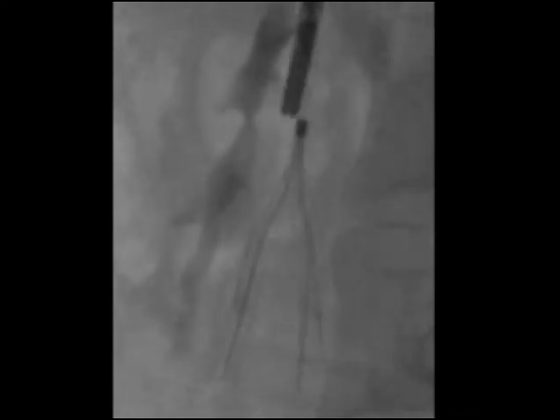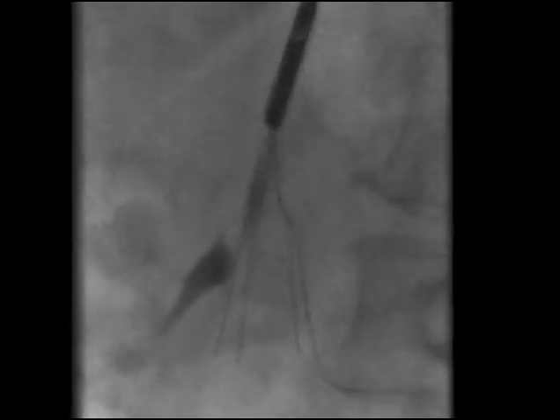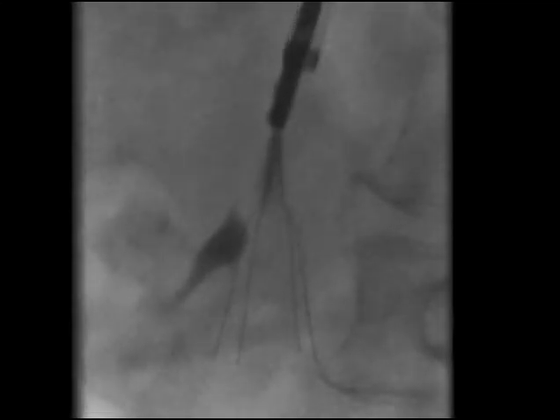Once firmly captured, the filter can be removed by over-sheathing, withdrawal, or a combination of the two. Sometimes, even if the manufacturer's instructions call for over-sheathing, a combination of the two is necessary, as in the case shown here where a filter strut is embedded in the bone.